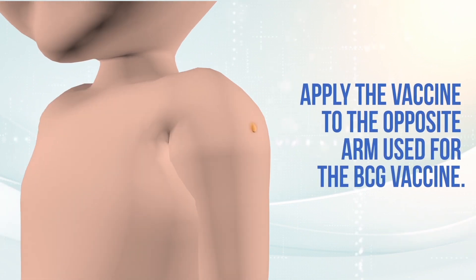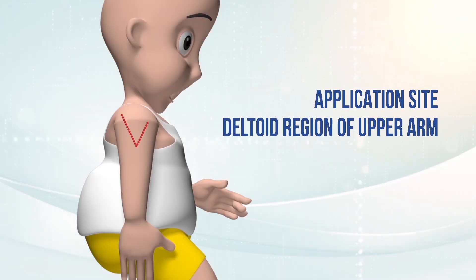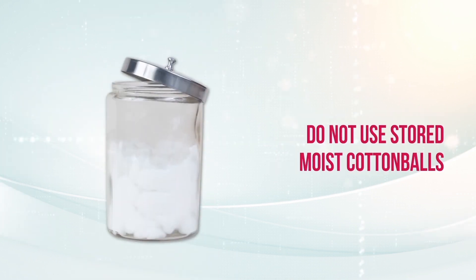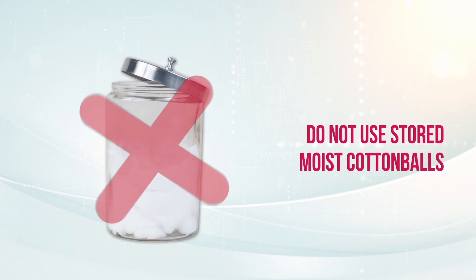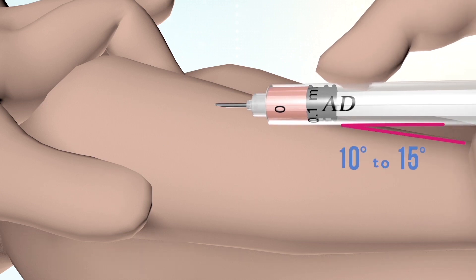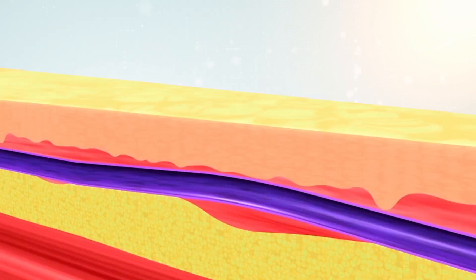Apply the vaccine to the opposite arm that was used for the BCG vaccine. Choose an area with healthy skin and tissue. Clean the skin with a cotton swab moistened in water, making centrifugal movements or going from top to bottom, taking care not to go over the same place twice. It is not recommended to use moist cotton balls stored in multiple unit containers. Stretch the skin between the index finger and the thumb. Place the syringe parallel to the child's skin. Insert the needle into the skin with the bevel facing up at an angle of 10 to 15 degrees between the skin and the needle, so that the tip of the needle is visible under the skin.